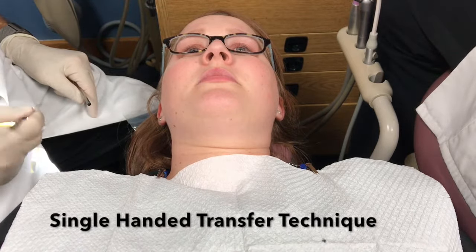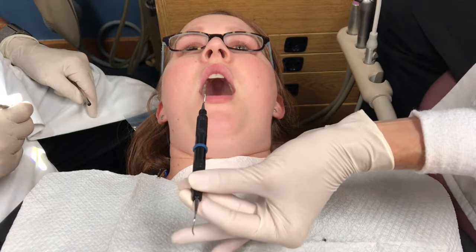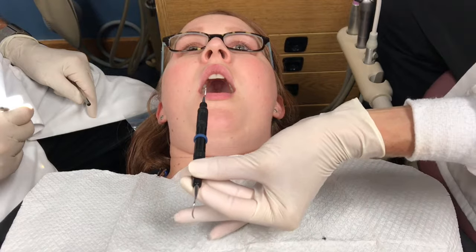Transferring instruments with the single-handed technique. Pick up the instrument from the tray setup using the thumb, index finger, and middle finger of your left hand. Grasp the instrument at the end of the handle or opposite the working end.